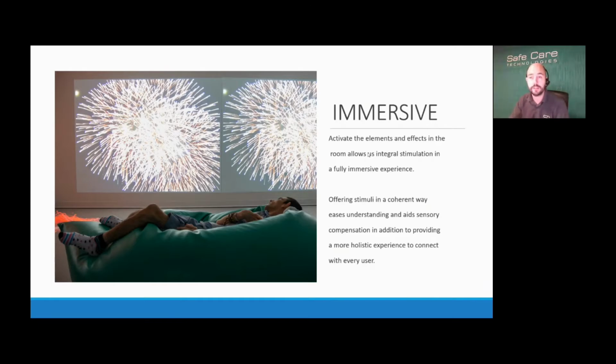And you could have it as basic as you want. Maybe you just want to work on just the vibration element. You can do that using the furniture, or even a cushion. Or maybe you want to have that fully immersive scene, for example, stepping into a forest, where you want the room to light up green. You might want the vibration of maybe elephants in that forest walking past you, and the sound then as well of the forest sounds, maybe the rainfall, maybe the animals as well.